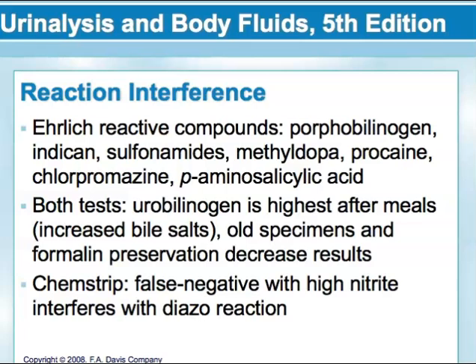which allows urobilinogen to be broken down or photooxidized to urobilin, and can also be seen when there are high concentrations of nitrite, but that would be in your ChemStrip only.